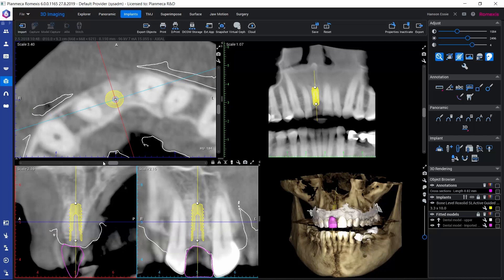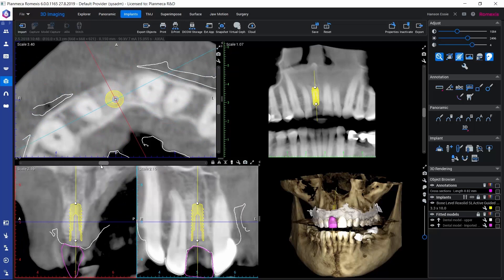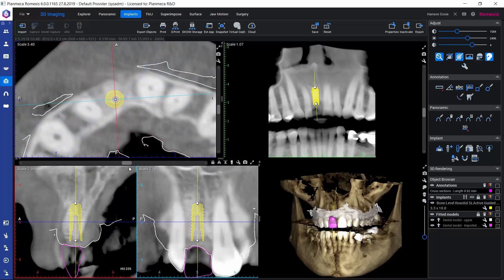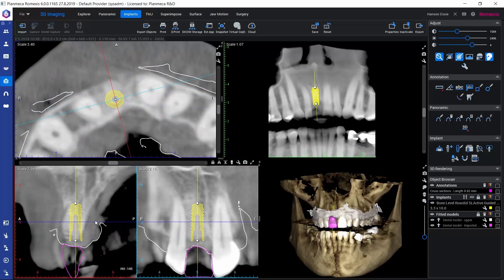We could also rotate these views around by grabbing the slider above them. This would allow us to see the bone all around the implant. On the slice views, we can also see the relative bone density displayed by the Hounsfield unit value at the location where our mouse currently is.